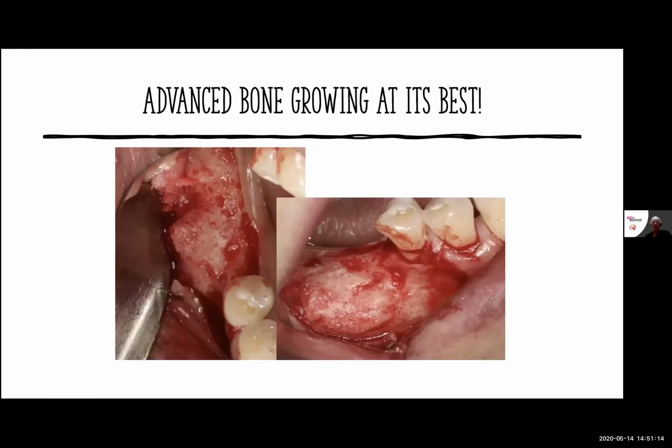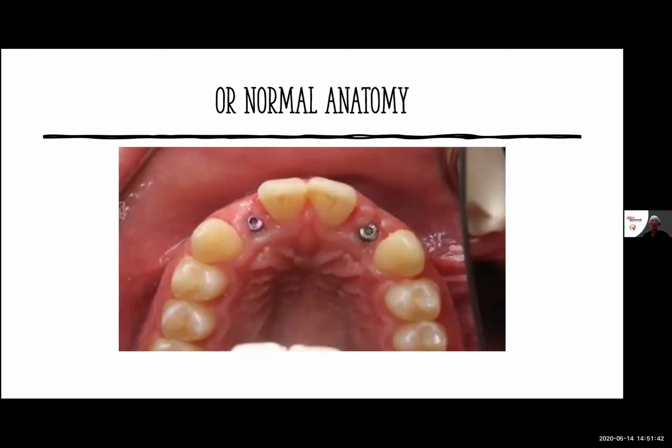And so here's an example of the tori that was grown. This is a pretty good sized tori that's grown. Oftentimes at the beginning steps, you're going to then come back and trim this bone back because you've got too much. Once you get the technique down and have been able to determine how much width you need, then you'll be able to have less and less space that you're doing in order to keep a good condensed and tight tunnel that's going to be there.